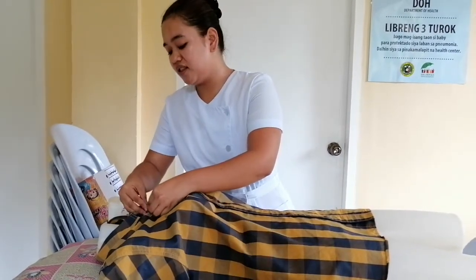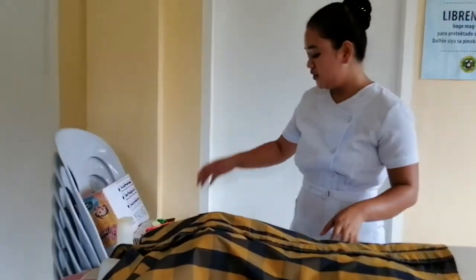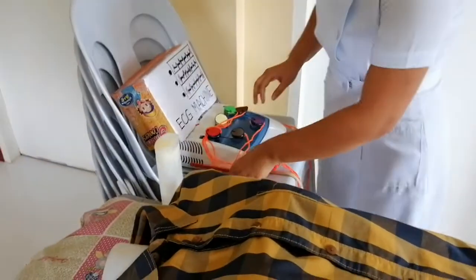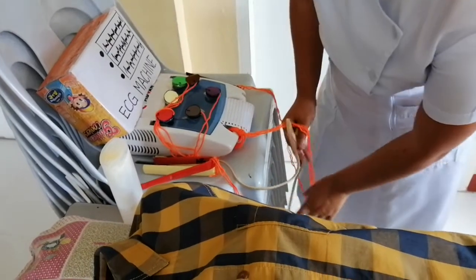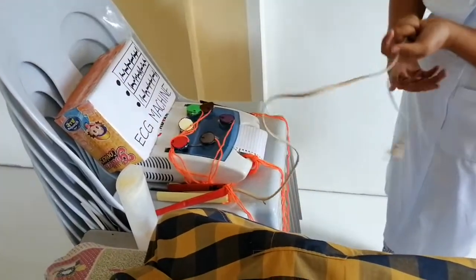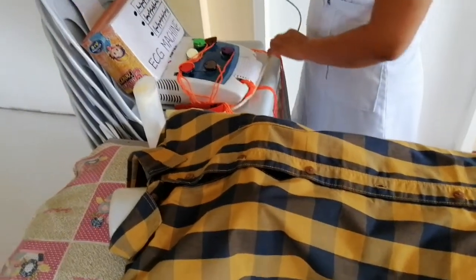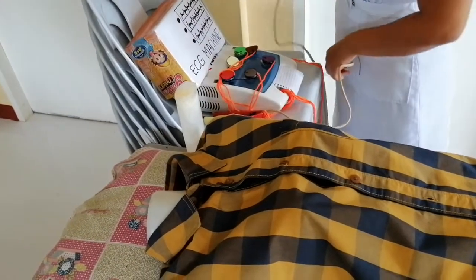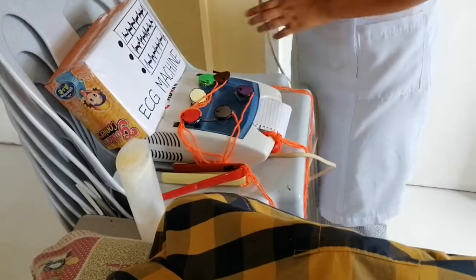After doing that, let's now proceed to assembling our equipment. The equipment is already assembled. Make sure that the machine is placed close to your client, and then you plug the outlet into the wall. So assume I have already plugged it in.